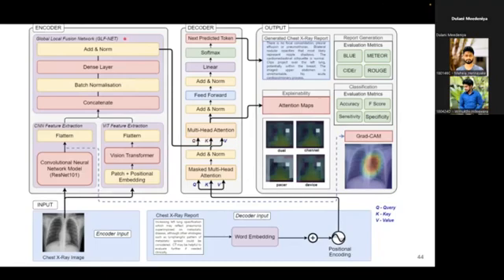So in the decoder, reports are taken as the input, and they are converted into vectors and stamped with their positions. Then those vectors are passed into the first multi-head attention layer. As you can see, there are 2 multi-head attention layers in the decoder. The first multi-head attention layer understands the context of the input medical reports and then passes it into the second multi-head attention layer. So this is where the mapping happens between the extracted features and the reports from the first multi-head attention layer.